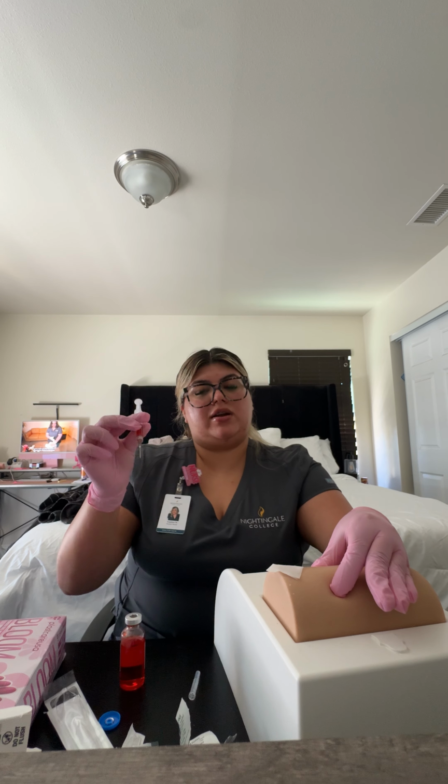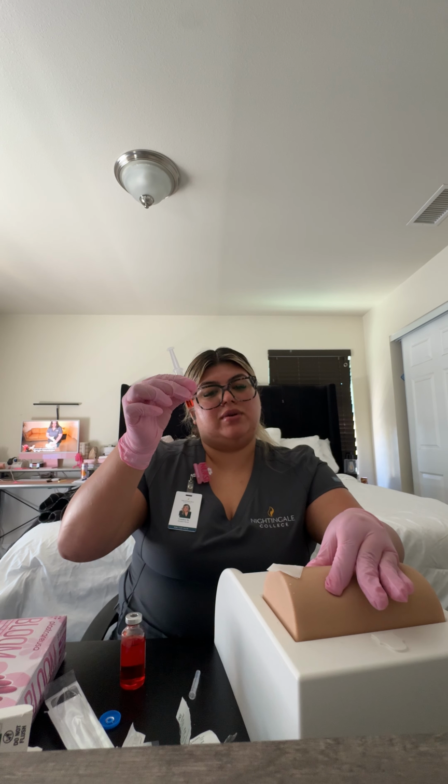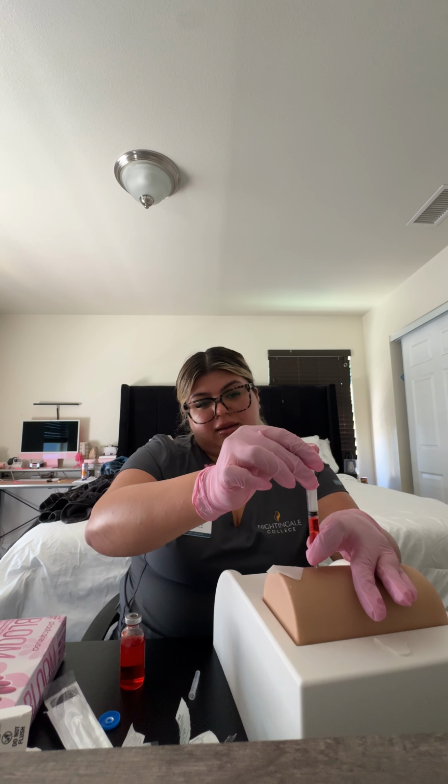Okay, so once we've done that, it is air dried. We're going to remove the cap. Going to place my hand there and then spread out the skin. We're going to hold our needle like a dart, and we are going to inject the medication nice and slowly. So what we would do is we would stabilize it, and then we want to pull back for about 5 to 10 seconds to see if there's any blood.